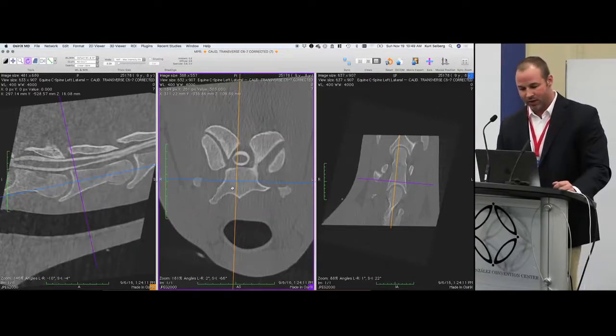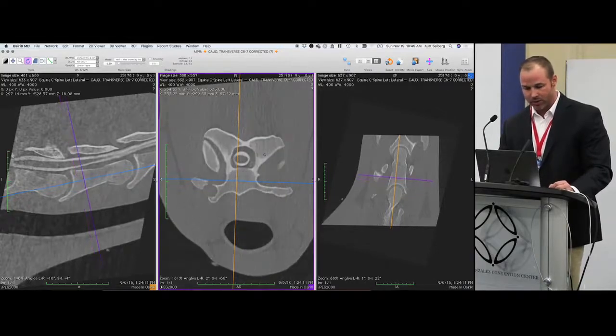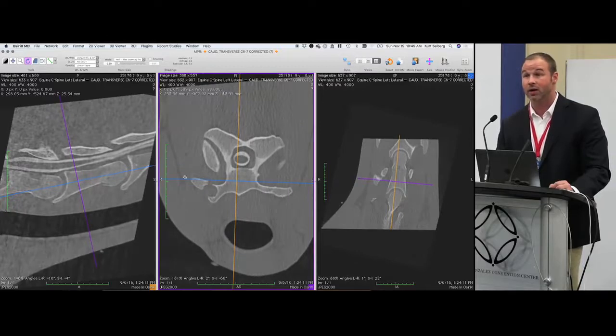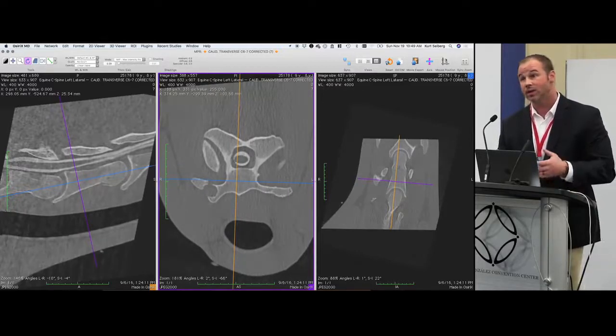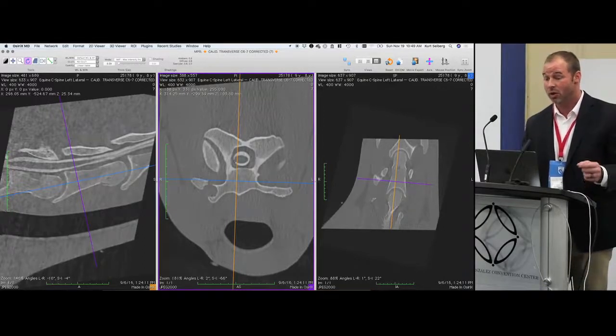And this is giving very, very nice resolution between our soft tissues as well as our bones. So very nice trabecular bone. We're starting to see our soft tissues coming in here a little bit better. And notice that the contrast shows up very nicely. In this technology, we do see that very nicely in our myelograms and our cone beam technology as well.